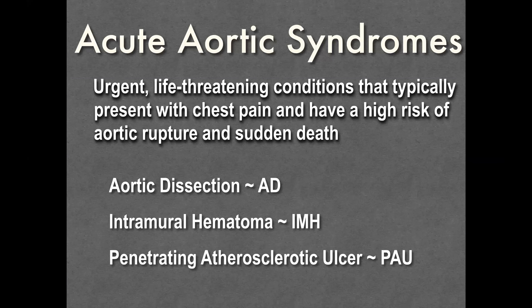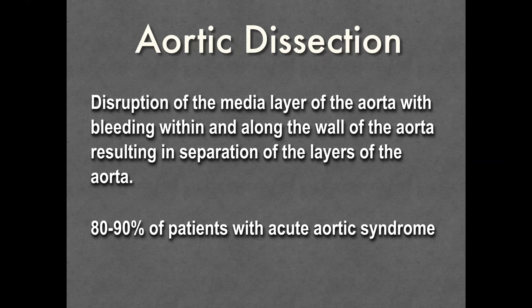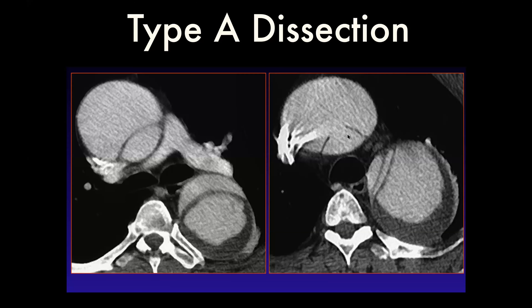Aortic dissection is a disruption of the medial layer of the aorta with bleeding within and along the wall, resulting in separation of the aortic layers. This represents about 80–90% of patients with acute aortic syndrome. Here you can see a classic type A dissection. Type A dissections involve the ascending aorta; type B dissections do not. In this case, the ascending aorta is involved with the intimal-medial complex and an entry tear, with aneurysmal dilation of the descending aorta showing false and true lumens.